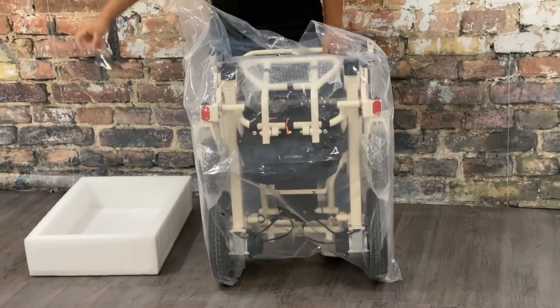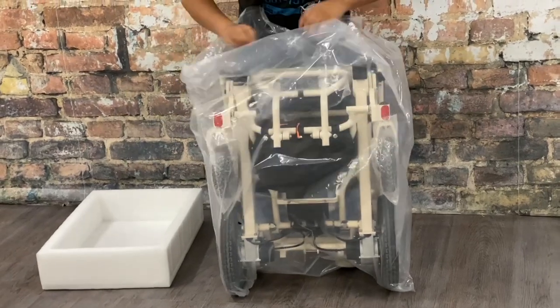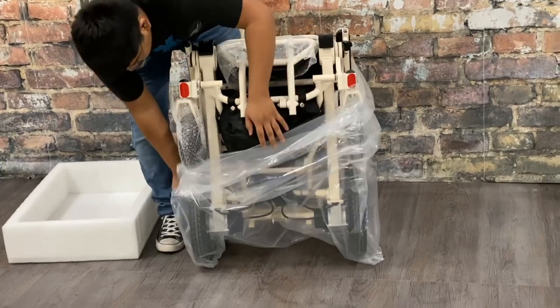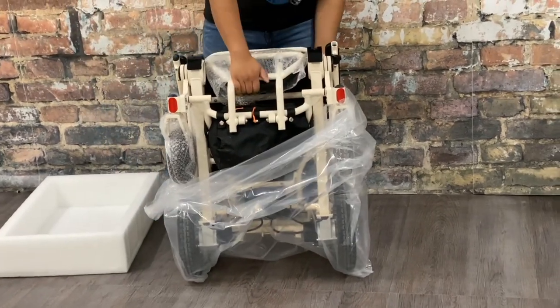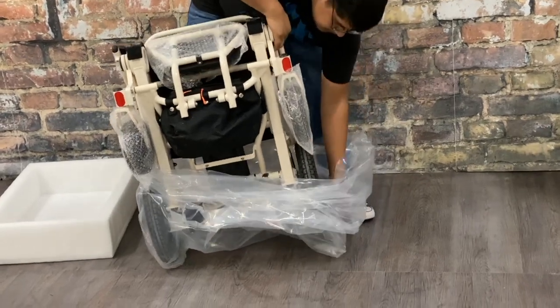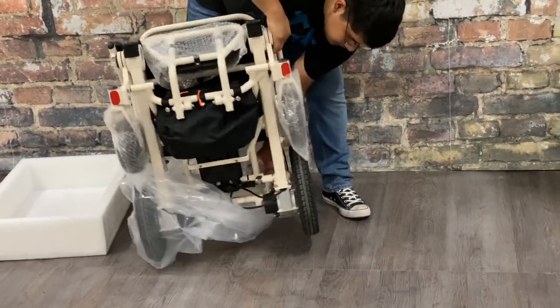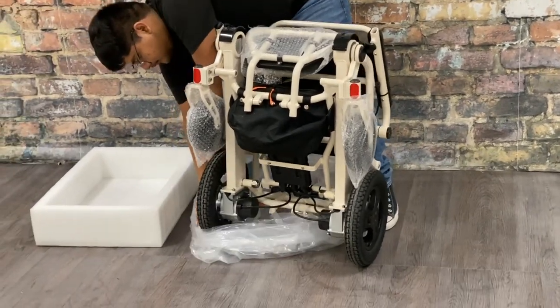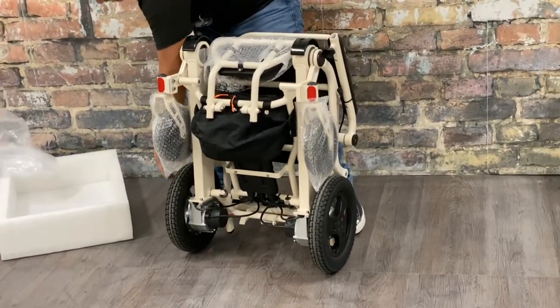Now it's time to undo the wrap. Undo the plastic wrap, slide it all the way down to the bottom wheels, and then grab one side of the chair and just tilt the tire up to get the bag out from underneath it. You're never ever physically lifting the chair — you're just leaning it to one side or the other to get all the packaging off.